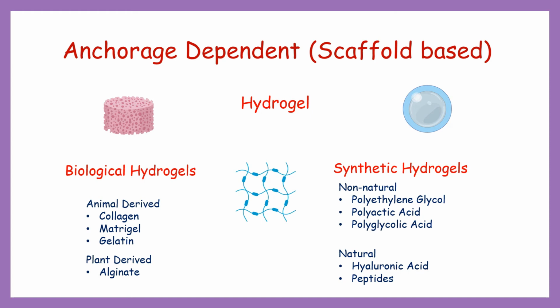Polyethylene glycol, polylactic acid, and polyglycolic acid and other unnatural polymer hydrogels have the advantage of being comparatively inexpensive or relatively inert and have reproducible material properties that are usually easy to tune through synthesis or cross-linking, thereby supporting the acquisition of consistent results. On the other side, unnatural polymers lack adhesive moieties found in natural ECM and require cross-linking of biological peptide to the scaffold to improve functionality.